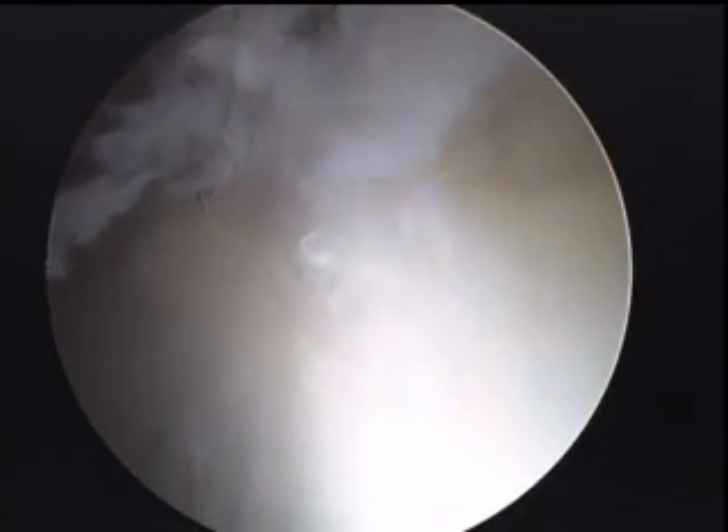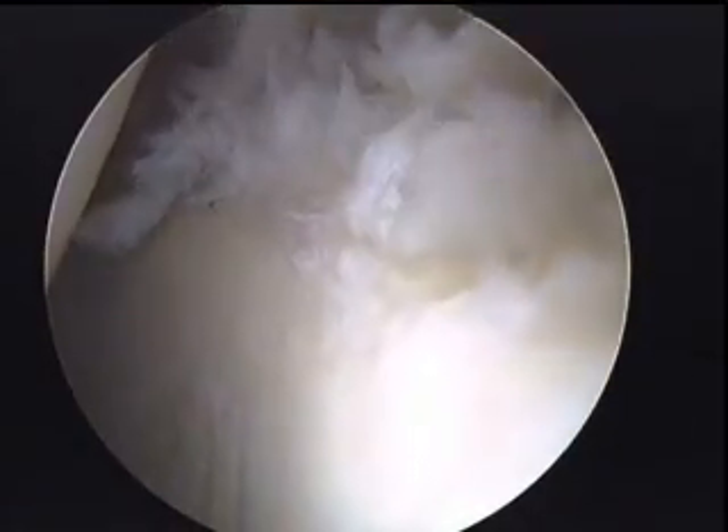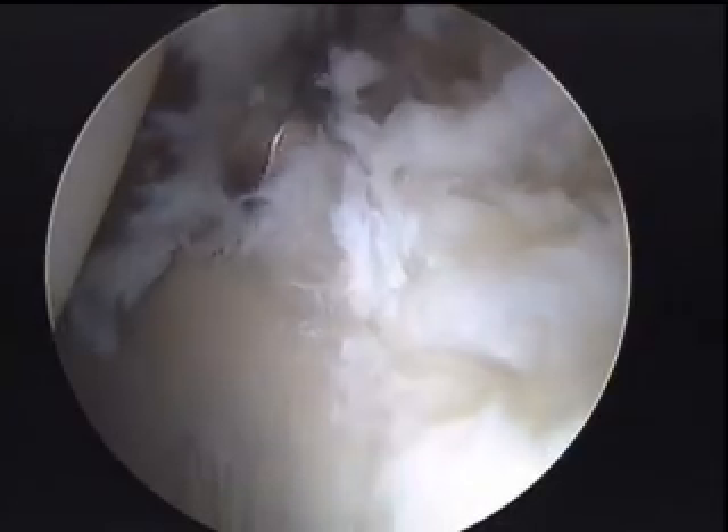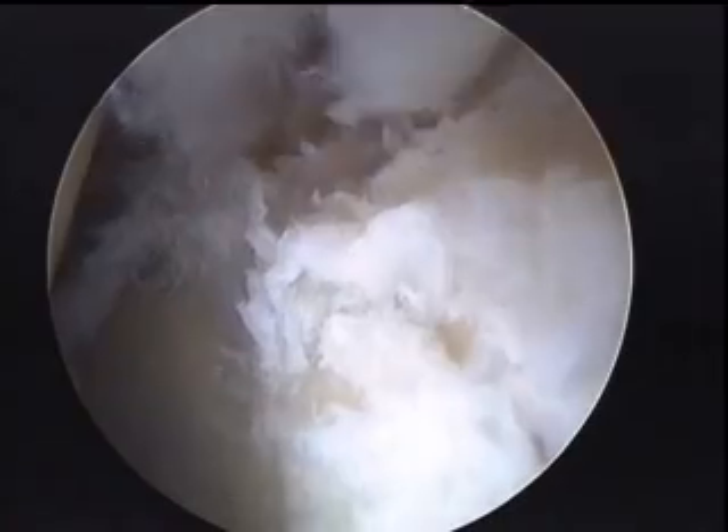Right now we're separating the tissue from the rim of the acetabulum where we will be doing our rim trimming. You can even see with putting it down in there some soft cartilage, and this is all area that had been damaged from the continued impingement of the bony abnormality of his femoral neck constantly impinging this area. It is a cam lesion.